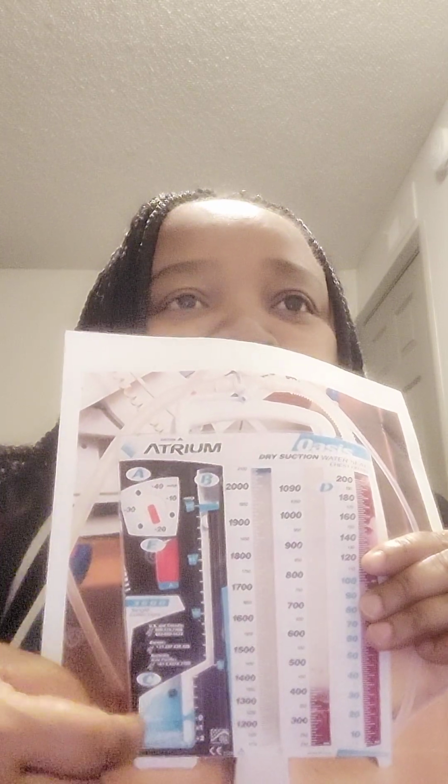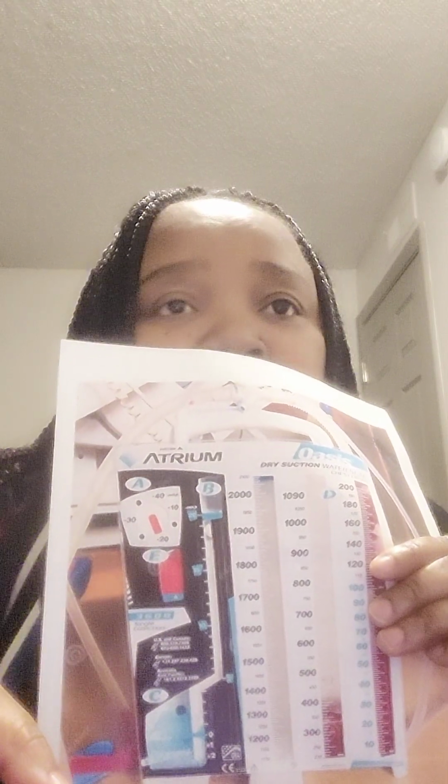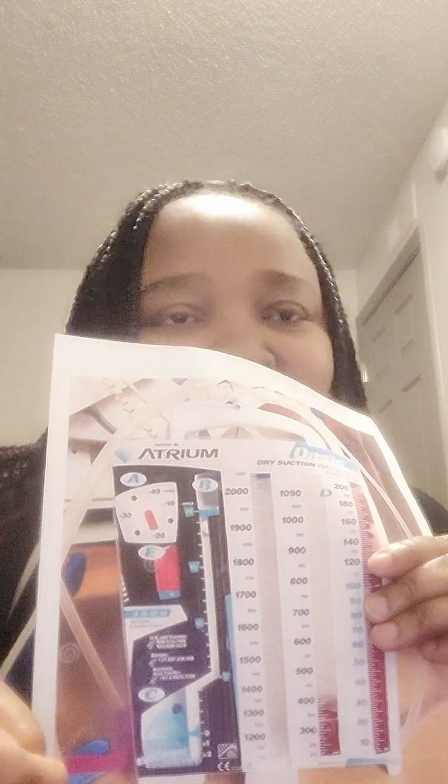There is another connection between the tubing and the chamber itself, so you should also make sure that all the connections are tight. So for tidaling over here, you know where I said there is a ball that goes up and down here, so that is tidaling. If there is no tidaling, it can mean two things. It either means there is a blockage or the lung has re-expanded. So make sure you find out what it is that is obtainable at that time.